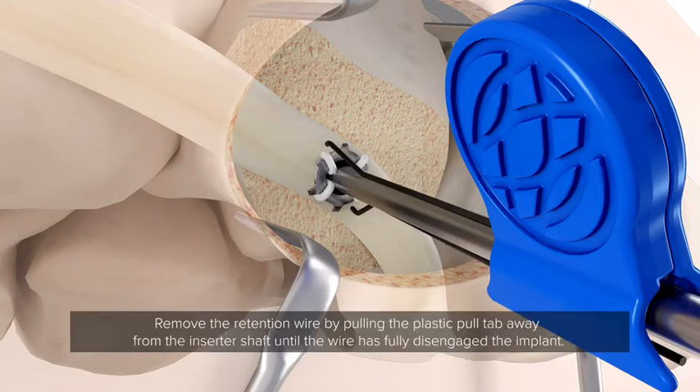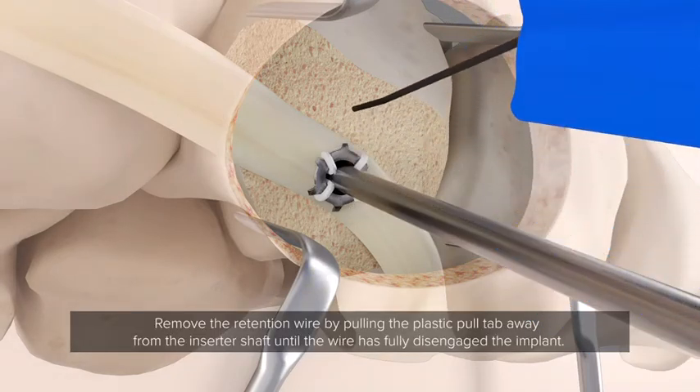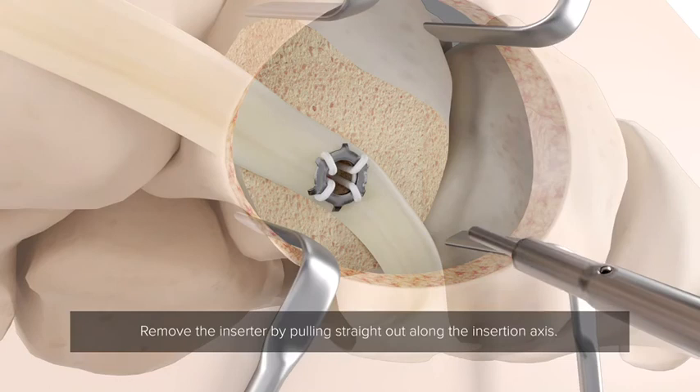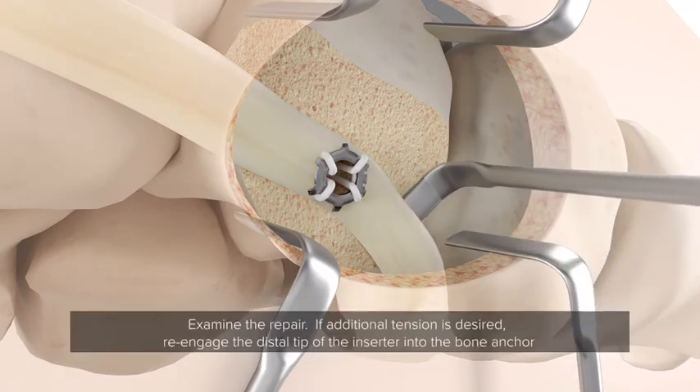Remove the retention wire by pulling the plastic pull tab away from the inserter shaft until the wire has fully disengaged from the implant. Remove the inserter by pulling straight out along the insertion axis. Examine the repair.